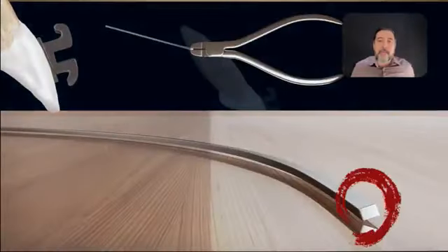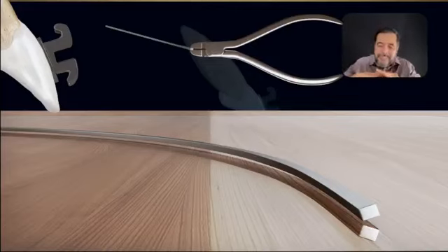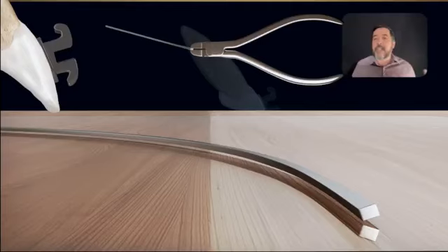So in this case, I prefer to use the concept of the passive torque to do the retraction or proclination, because with the passive torque in this combination, a .022 slot and a .019x.025 wire, I will keep a good movement, a good control during the inclination.